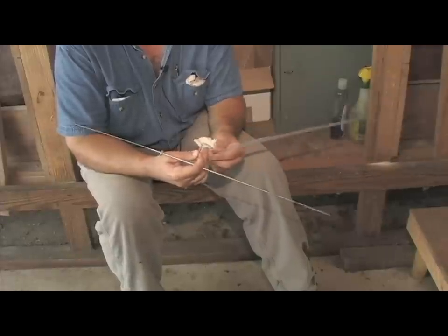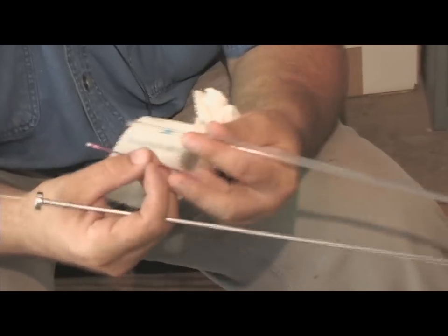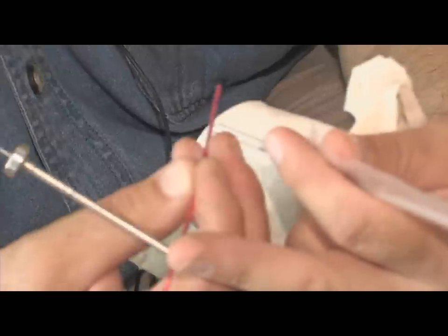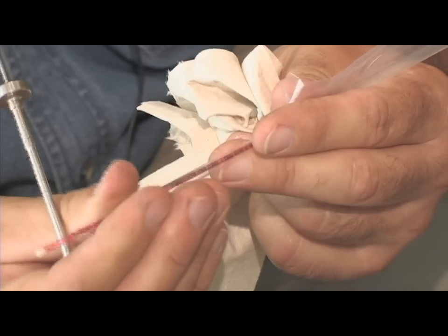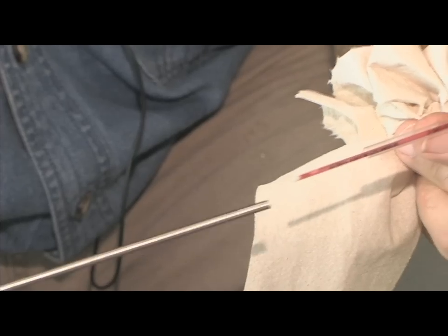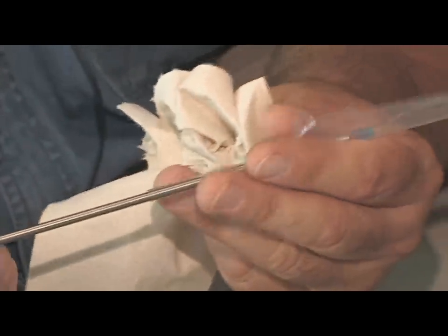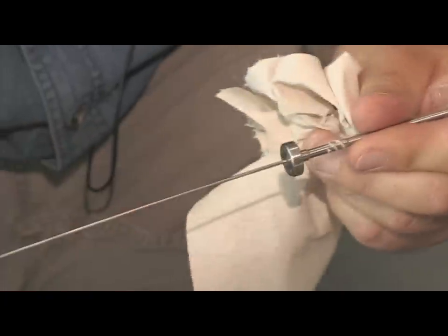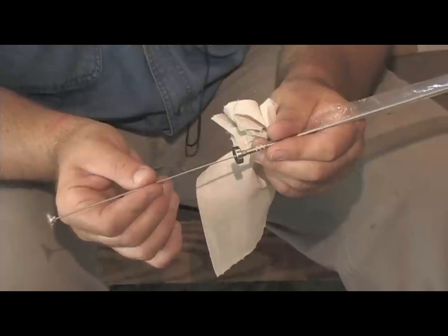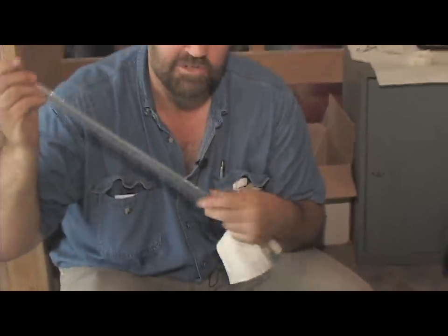Here's a new one right here. You'll take it just like that. There's a little blue thing there. These will actually be on this side — I'll just turn it around like I just cut it off. I just snipped off the end. Then your little corks are on that end. You just start it right there, push it up until you're about that far, and then you can thread it like so, all the way up. Then you push it forward and thread it here. Then you can push your plunger forward until you feel just a little bit of tension — you'll feel it touch that straw — and you stop.